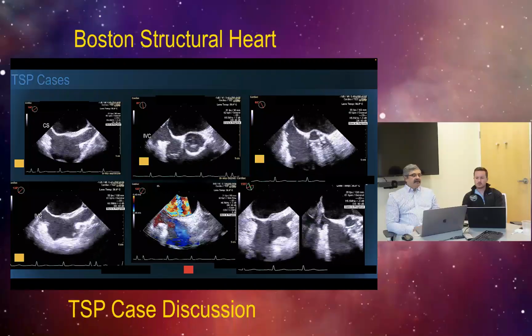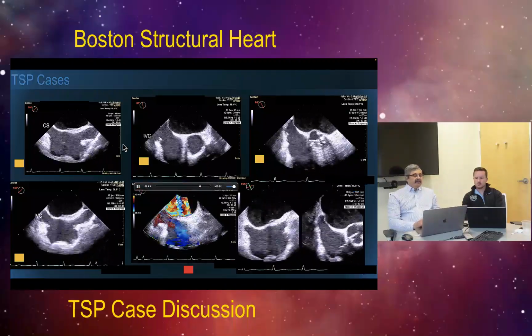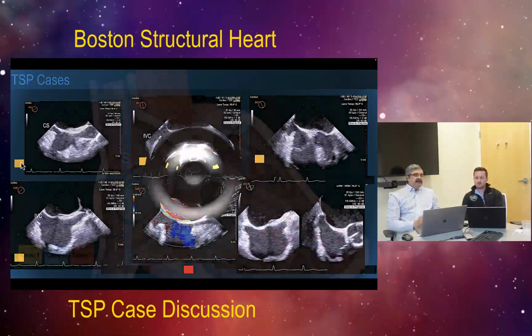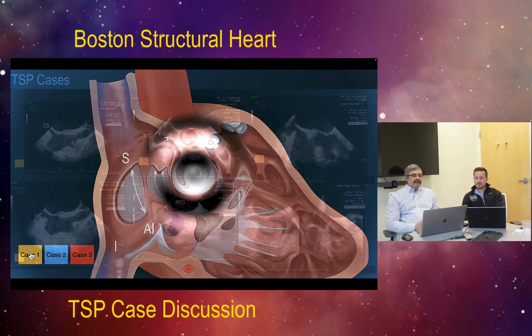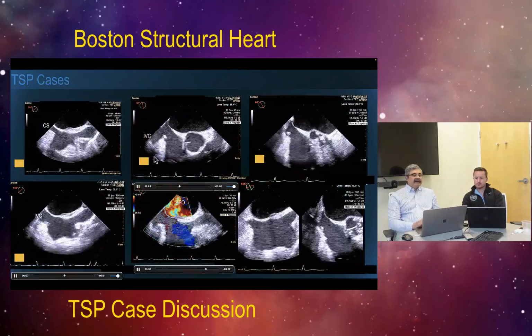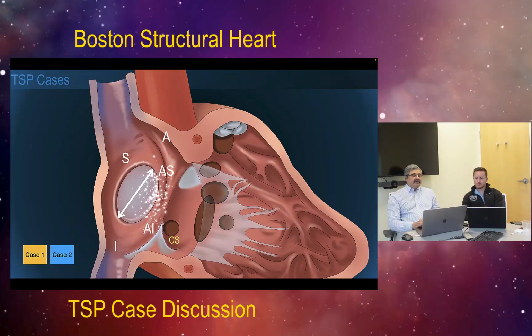This is the mid-esophageal bicaval with the coronary sinus. This is the AP view. So if I look at the bicaval window, just for reiteration, these are the views that we are looking at. That's the superior and anteroinferior aspect of the septal puncture that we're looking at. The same goes for the short axis view. This is the aortic valve. This is the anterior aspect. And when you look at it, we are looking at the anterosuperior and somewhat posteroinferior margin of the intraatrial septum.